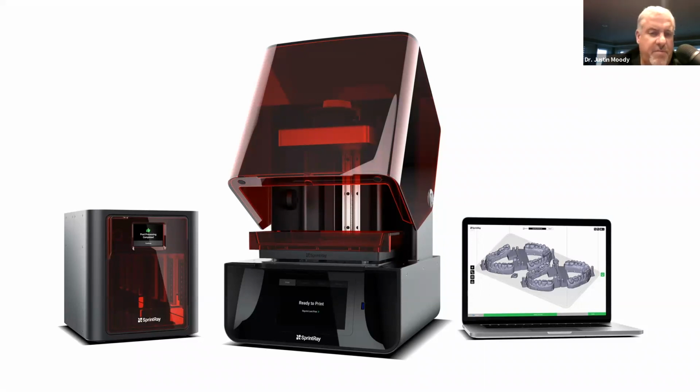I've used a number of different printers over the years, and again, we've settled on working with the SprintRay, and I want to spend the last part of this webinar talking about how SprintRay has really created a digital workflow that allows us to make surgical guides in a very easy and predictable fashion.